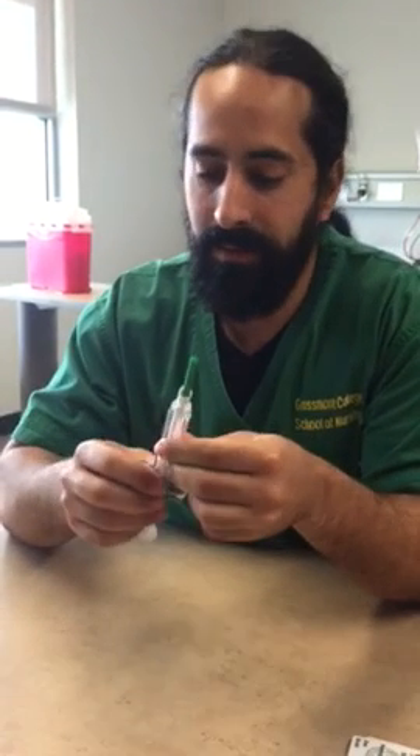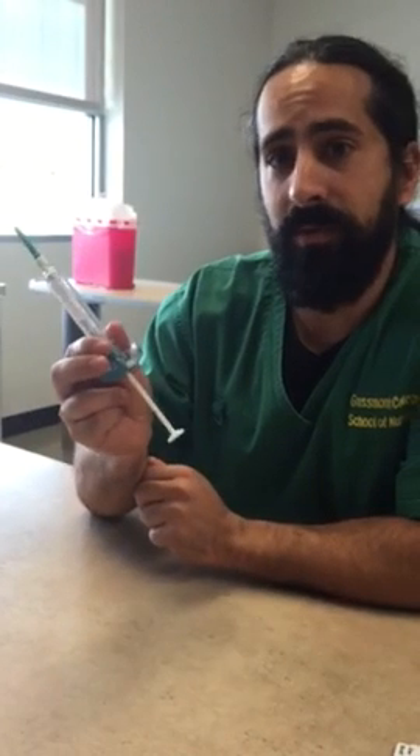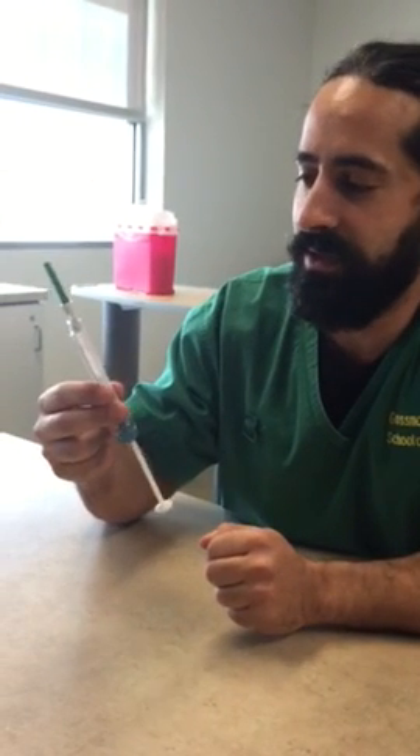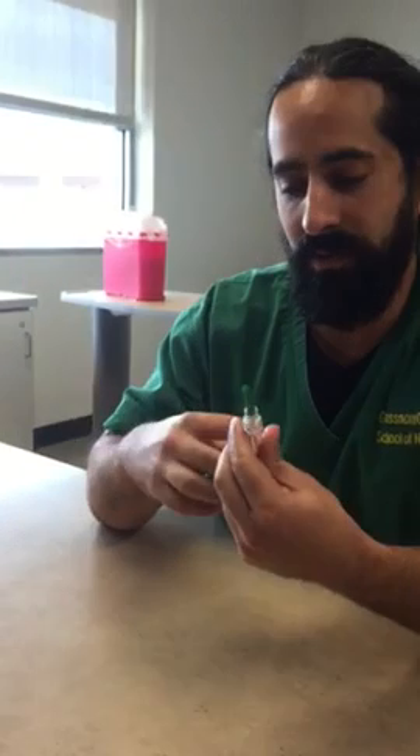We're going to give the prescribed amount, and if there's too much in the vial we're going to have to waste some of it. We're going to do it into a medical receptacle. A lot of times we're going to give narcotics and controlled substances like Dilaudid or Morphine, so we're going to need a witness.